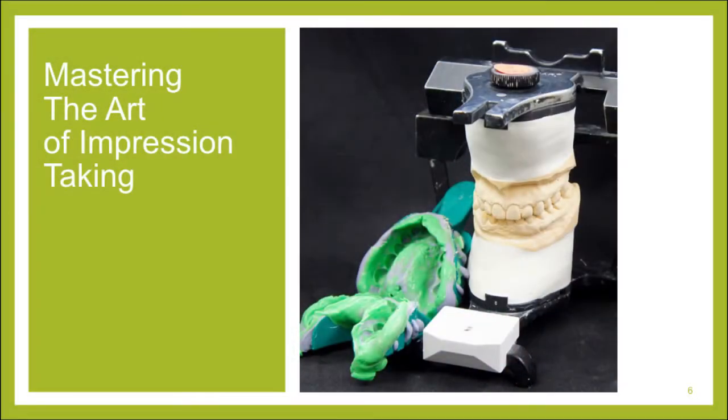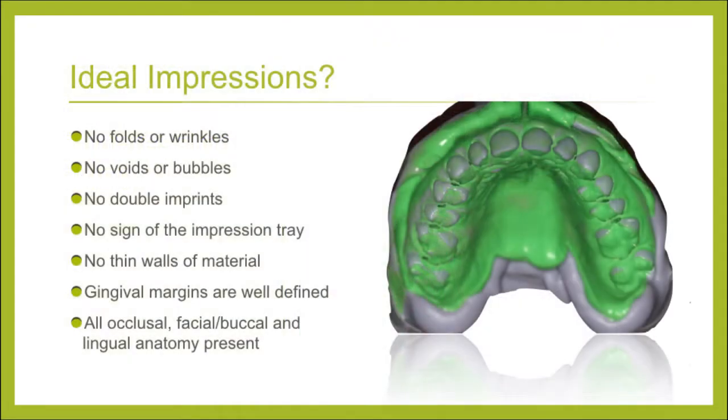Mastering the art of impressions, you have to understand what is ideal. I never really had anybody tell me, hey, that's bad and this is why. So this has really been our focus for the dental assistant, because we take a lot of impressions and dental assistants really don't know what they're looking for or looking at. We don't want any folds or wrinkles in the material. We also don't want any voids or bubbles. We don't want any type of discrepancy in the margins.